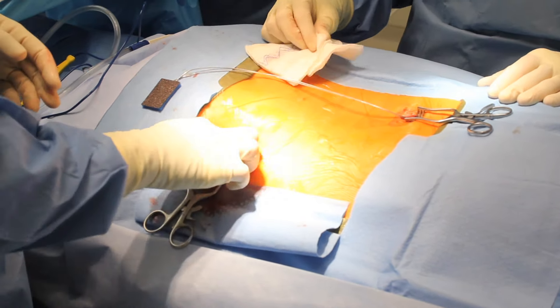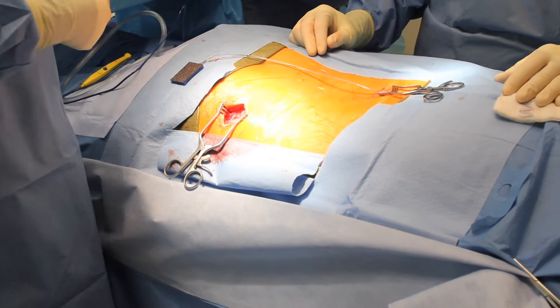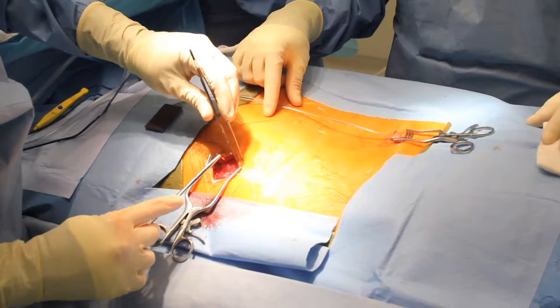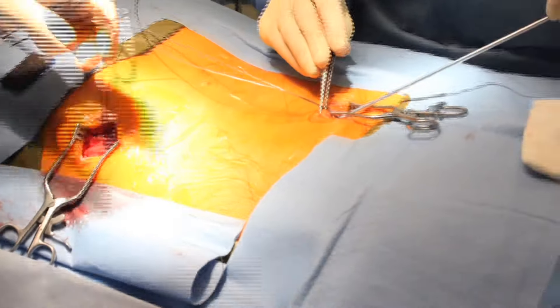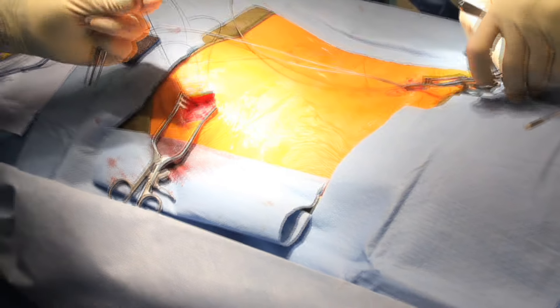The needles are removed, the wires are pulled into the surgical site, sutures are placed to hold the battery down, and the wires are tunneled from the back to the buttock site and anchored to the muscle.